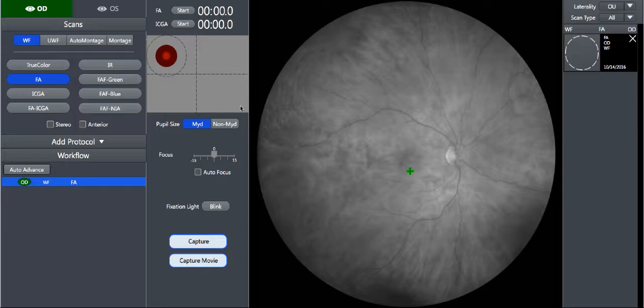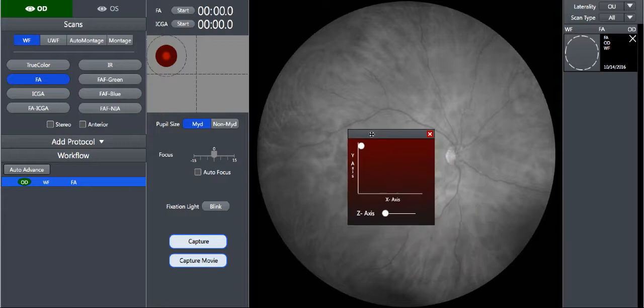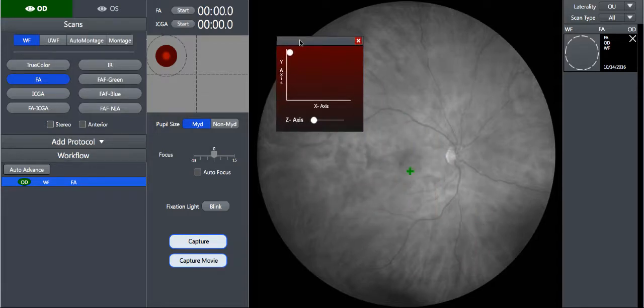I designed an illustrated representation of the eye in the alignment space with guides to show the optimal positioning of the camera relative to the eye. Alignment is managed by moving the camera using a joystick and rotary control. I had to simulate the hardware action, so I created this control panel to represent movement of the camera along the X, Y, and Z axes.